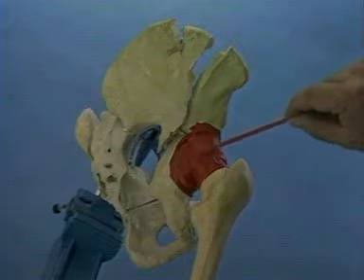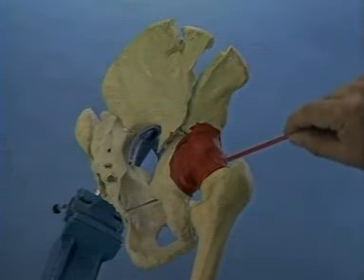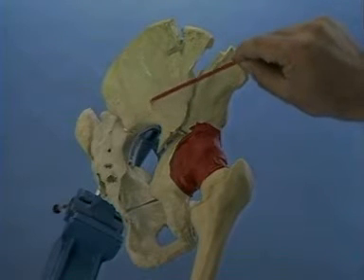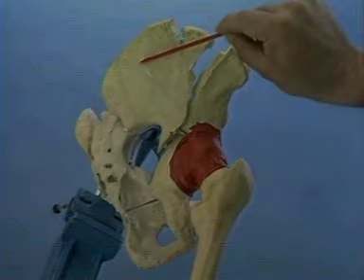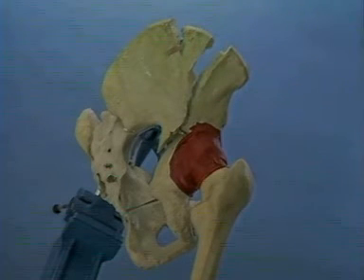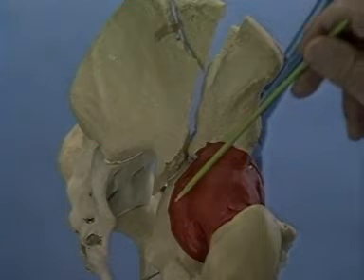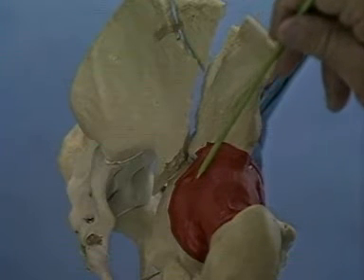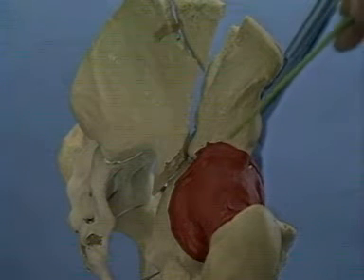Open reduction and internal fixation of this fracture can be performed through the ilioinguinal approach because the posterior column fracture is simple. That is, the posterior column remains in one piece. Additionally, there are no displaced fracture lines through the ilium that cross the sacroiliac joint. In both column fractures, the hip capsule typically remains attached to the anterior as well as posterior column, and the displacement at the acetabular rim is often minimal.